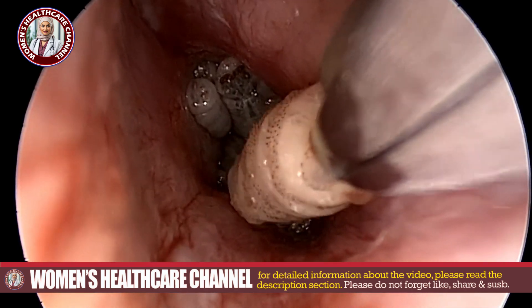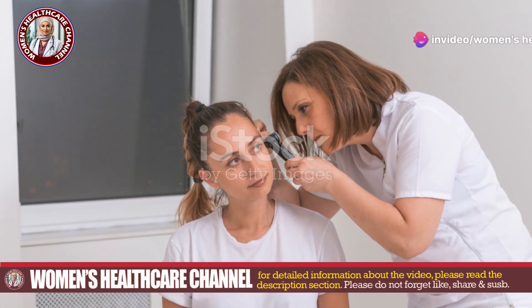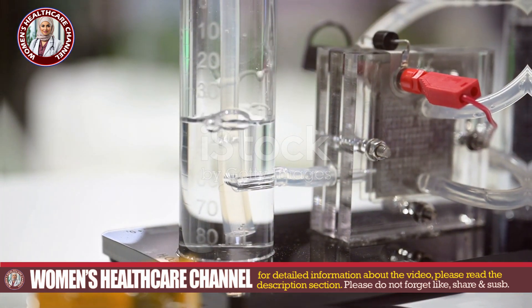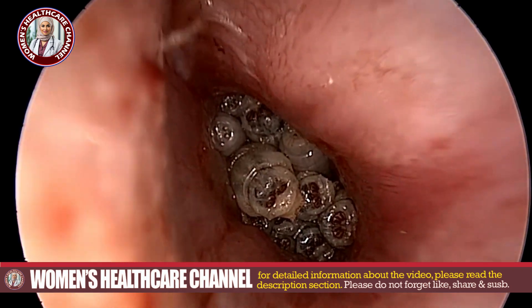Next, immobilize the maggots. Gently irrigate the ear canal with normal saline to clean out debris and dislodge any loose maggots. If they are actively moving, use a few drops of hydrogen peroxide solution. The bubbling action helps immobilize the maggots, making them easier to remove.